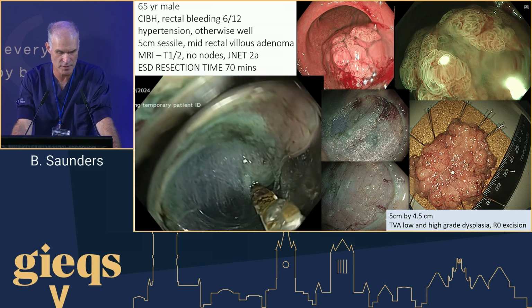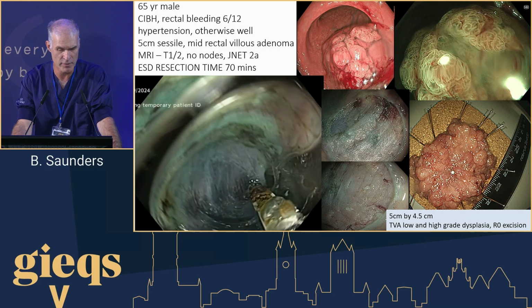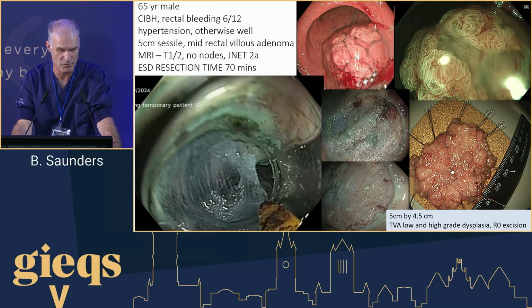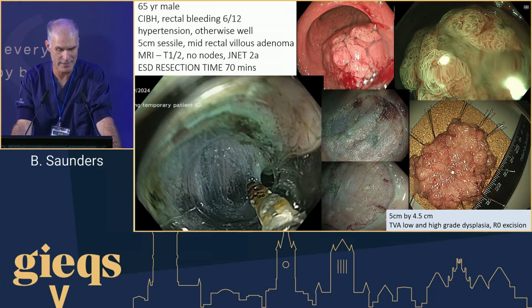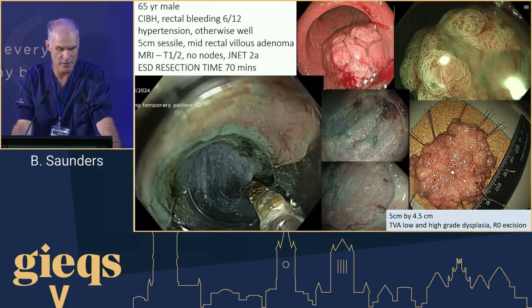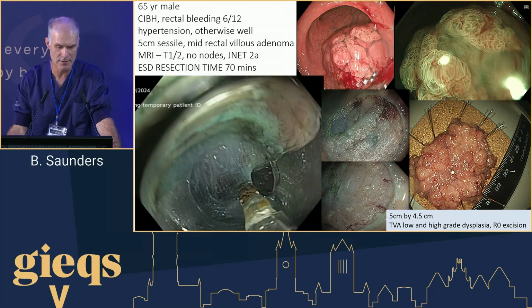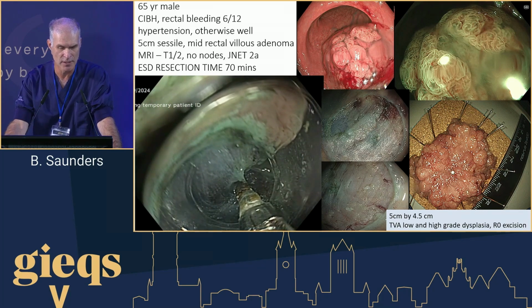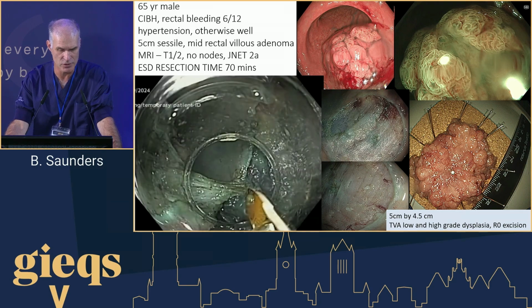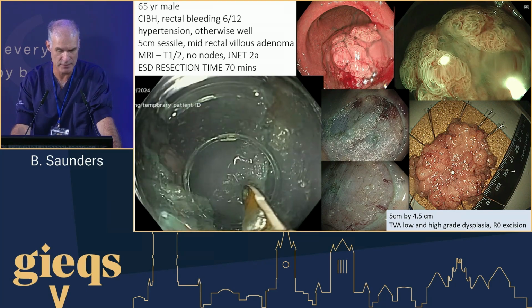The advantage with this device is we're not needing to do instrument exchanges. Now, the microwave is very effective even for larger rectal vessels. And we can microwave, coagulate, and then cut without needing to pause. A lot of the time implication with ESD, and the reason that ESD takes a long time, is the need for instrument exchange, and minimizing that is really crucial. So here's the final cut, just taking this lesion off.